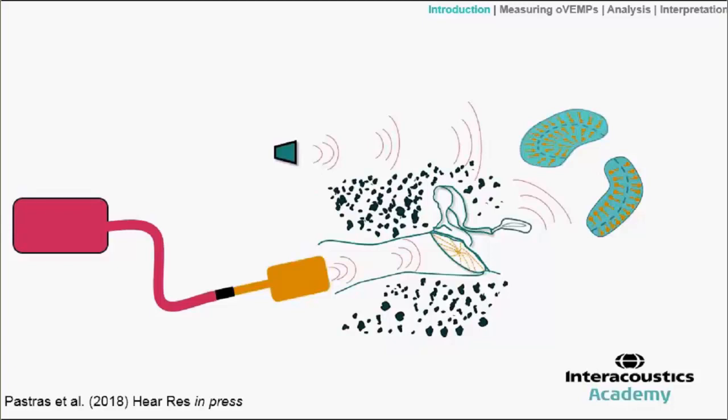So there are many similarities between the AC and the BC, and we'll talk about where the clinical application of those two modes come in later. But just note at this point that there are also some complex differences between the two.